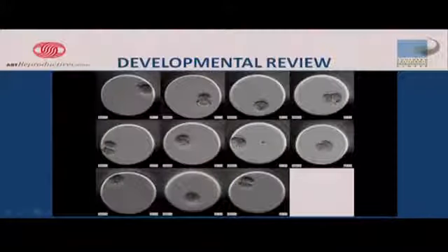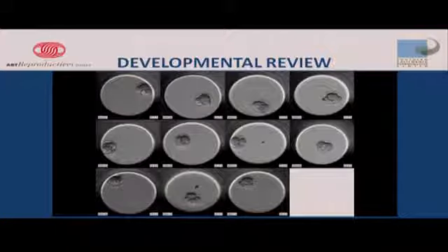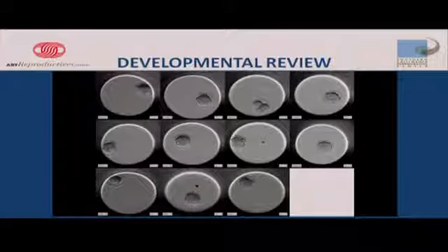So you can go ahead and start this one, Kevin. This happens to be a set of 11 embryos that are in there. And we look at them all, and as they develop, there's the 2 moving along. Some of them are about to go to, come on, 4 cells. You want these things to keep going all the time. You're like, come on, I know you can do it. But we go backwards and forwards many, many times to look at them.